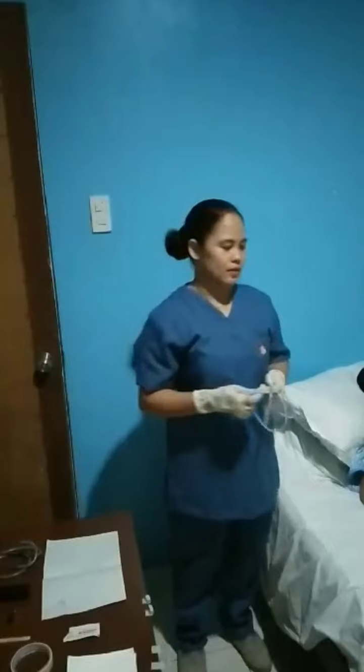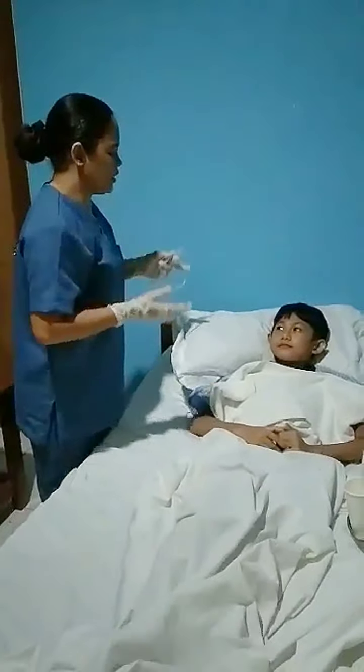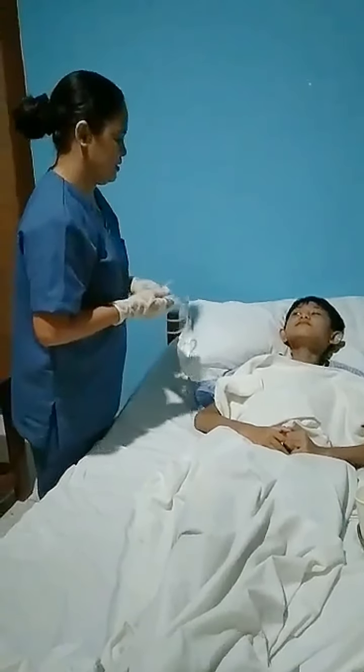Now that your tube is well lubricated, we may now gently insert the tip of the tube. We should have the patient's head hyperextended because that will flatten the curve of the nasal passage where it meets with the pharynx. We have to use gentle pressure and we should not force against resistance because forcing against resistance will damage the mucosa. So Ryan, I'm going to insert now the tube to your nose. Please hyperextend your neck just like this. Okay.